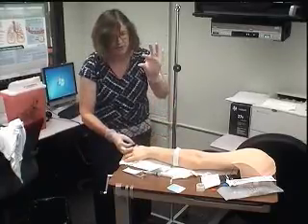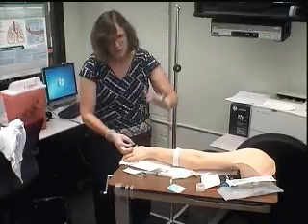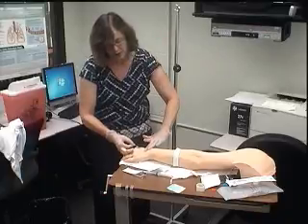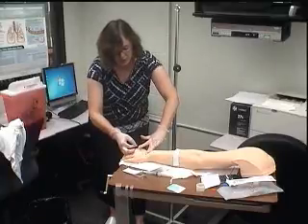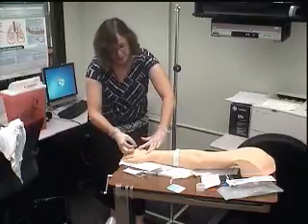So that catheter is about this long. I'm going to put pressure above on that vessel. I don't want to put it too close, because I don't want to push the needle up through my vessel. So I'm going to put pressure above where that needle catheter will come out. And then I'm going to stabilize this catheter with my finger and put it on the pink part. I don't want my fingers all over it though, but just stabilize it.